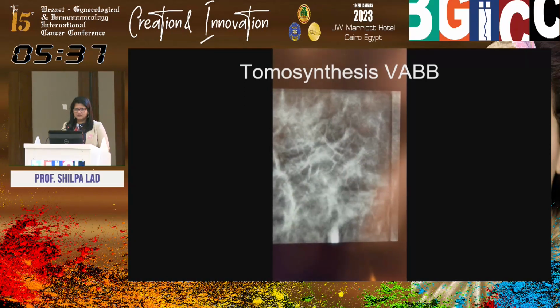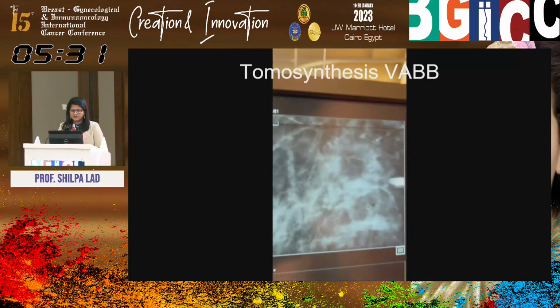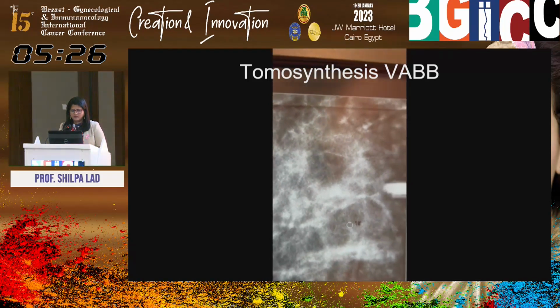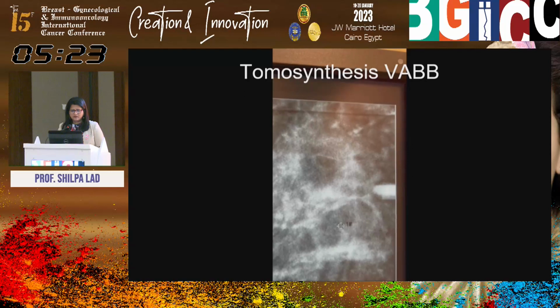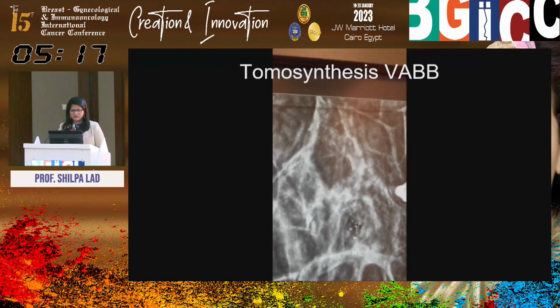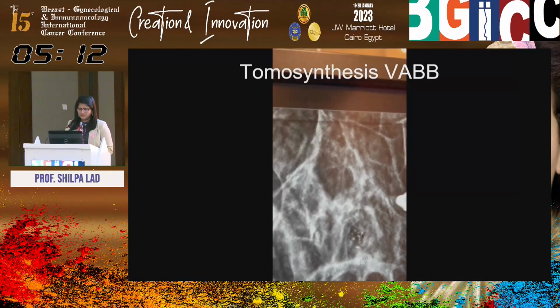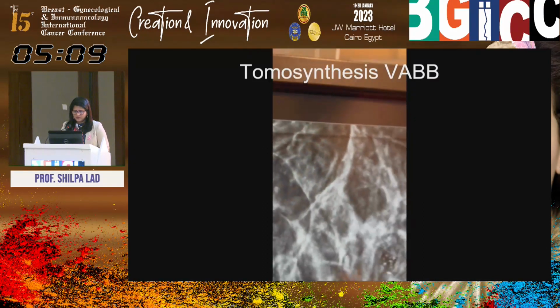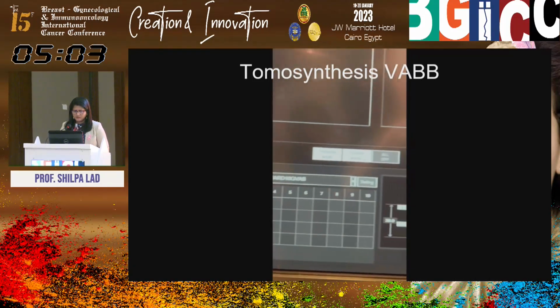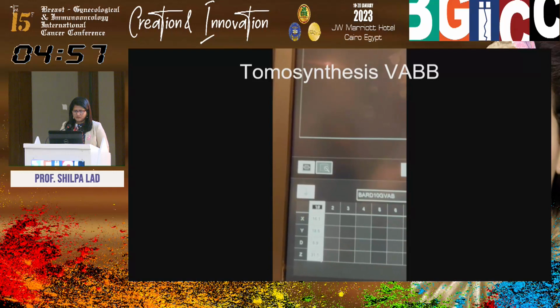Yeah, we've got those microcalcifications. They have probably moved a teeny tiny bit, and we will know that from our target. So if you notice, this is where we had initially targeted, okay? And if we scroll here, do we see those microcalcifications in that spot? Yeah, more or less the microcalcifications are in that spot, okay? So we are good to go, okay? So again, we will select, and this has already been selected because this has already been sent to the machine. So now we will go target.